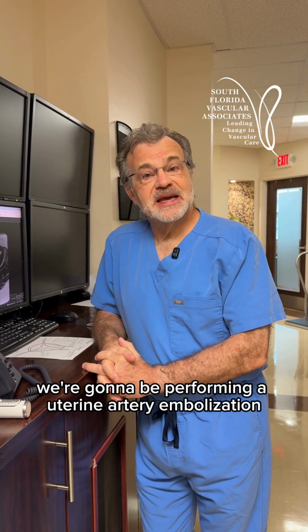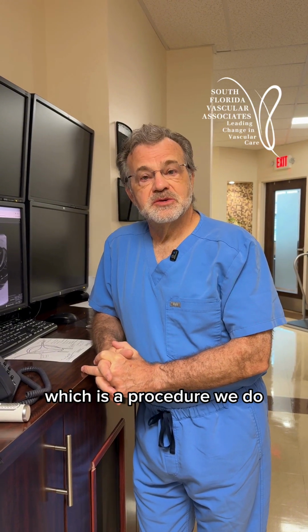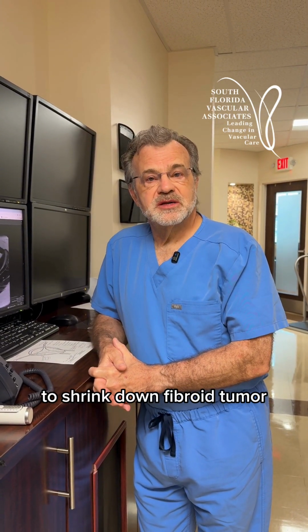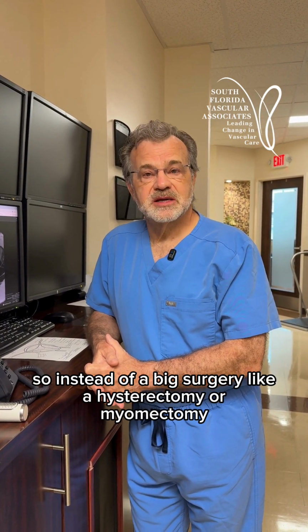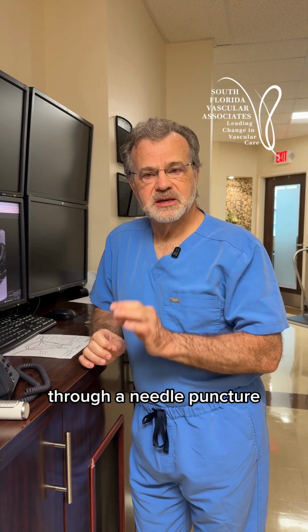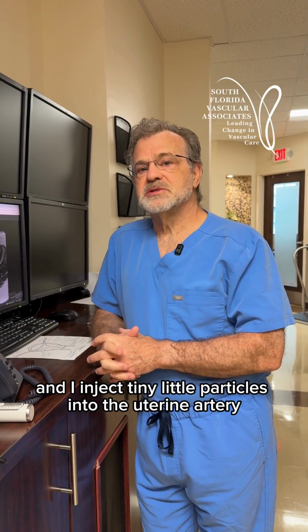We're going to be performing a uterine artery embolization, which is a procedure we do where we stop the blood flow to the uterus to shrink down fibroid tumors. So instead of a big surgery like a hysterectomy or myomectomy, we just go through the bloodstream with a little tiny catheter through a needle puncture and inject tiny little particles into the uterine artery.